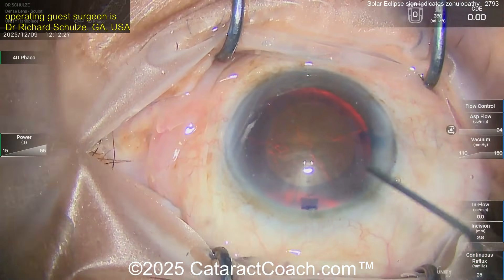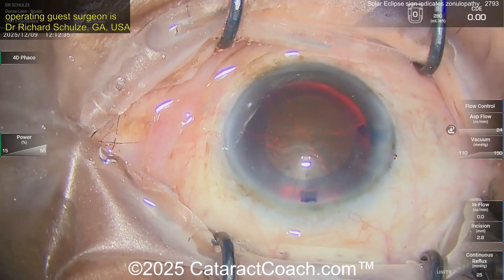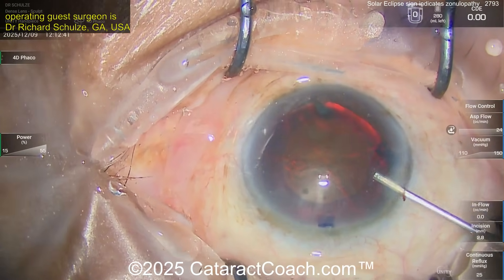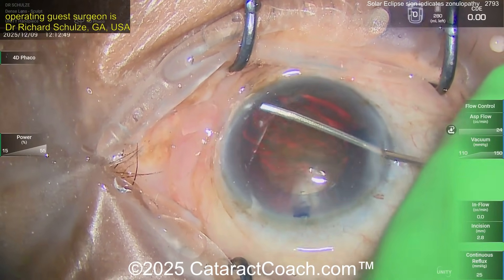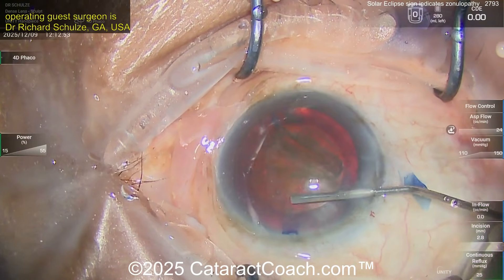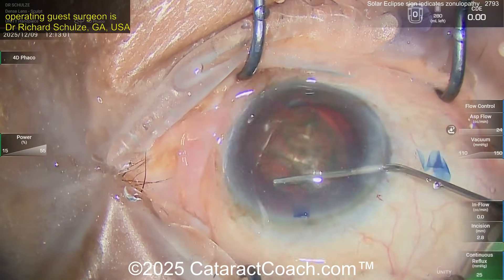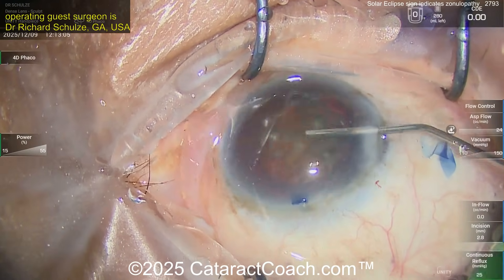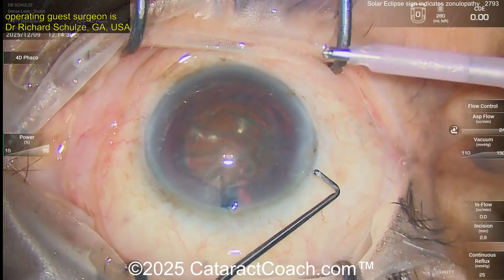Now let's see some hydrodissection. For a case like this you want to be very gentle when operating in the capsular bag because you don't want to put force on whatever zonulopathy is left. Here's some broad hydrodissection — good fluid wave coming across. Look at that: it rotates. My favorite saying is 'if it spins, you will win' — and this one is definitely spinning, so you're going to win this one. Coming in with the phaco probe in the right hand.